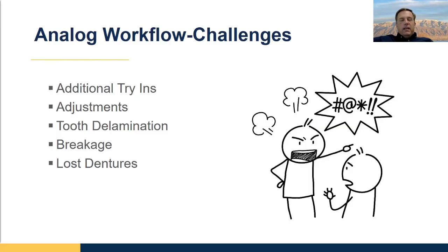It's unfortunate they get a poor result, but you talked about it and they chose not to do it. But if you don't have those conversations, or you don't have them recorded, that can be a real source of problems. And again, digital dentures won't fix a flat ridge, but with a proper occlusal design, they'll get you the most stability that you can possibly get on a given patient.